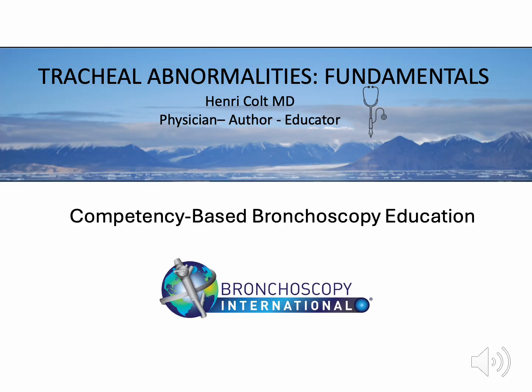I'm Dr. Henri Colt. This presentation is part of Bronchoscopy Academy, an ongoing competency-based curriculum in flexible bronchoscopy. The goal of this work is to improve procedural understanding, anatomical recognition, and clinical judgment, while helping reduce patient suffering associated with unequal expertise and inconsistent training.